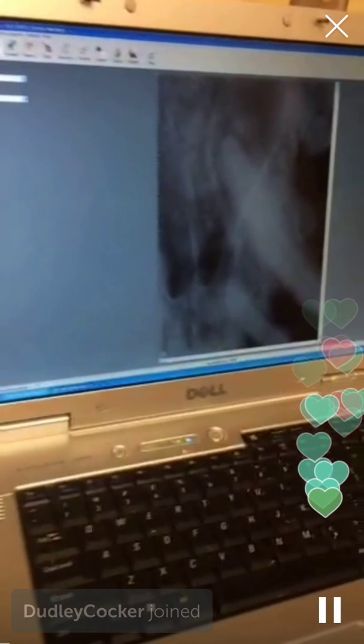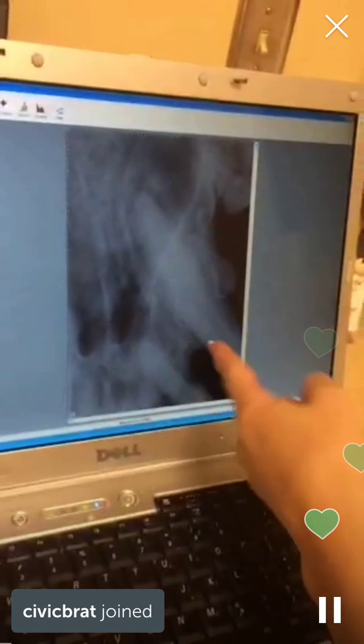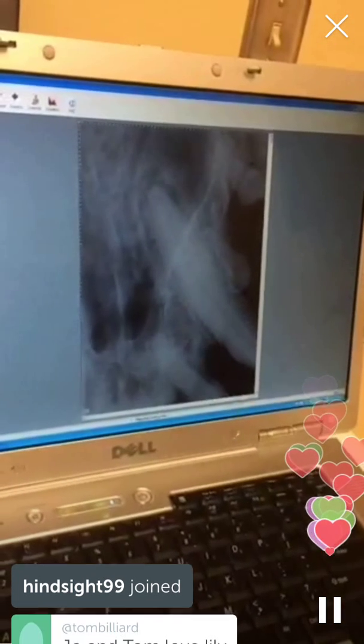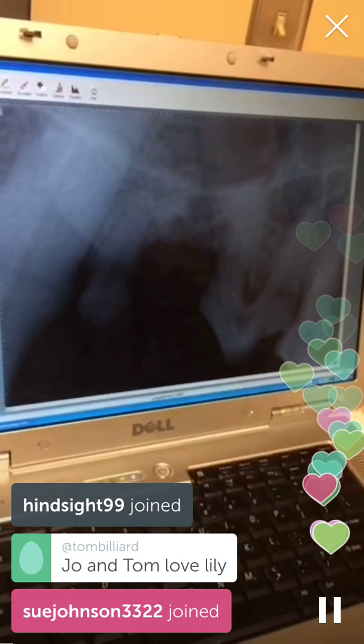And then next we look at the big canine tooth, this tooth here, and we look at the root. There's no decay of the root. The periodontal ligament is this little thin line that lies around the tooth root, and everything looks fine there. And we're on the left side now.